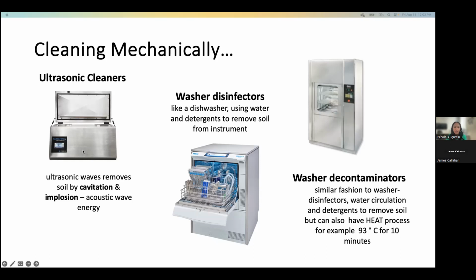There's actually fluid inside this ultrasonic machine, and that fluid doesn't have any antibacterial claims. So it's important to note that the solution inside these ultrasonic cleaners may have bacterial contamination. In addition, the fluid inside could result in endotoxin contamination of surgical instruments that can cause severe inflammation.